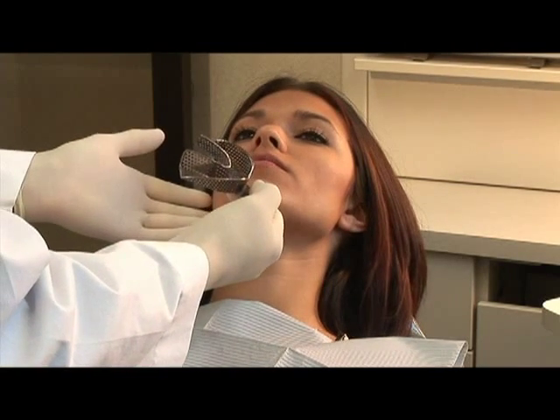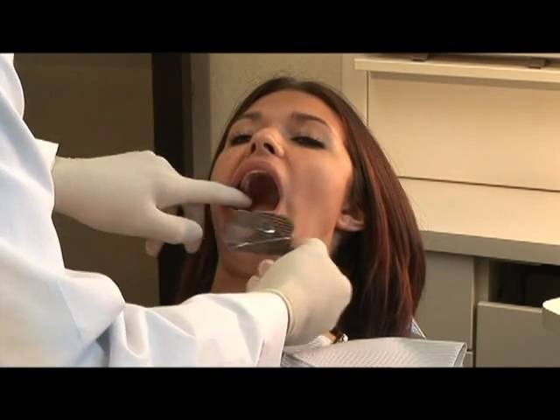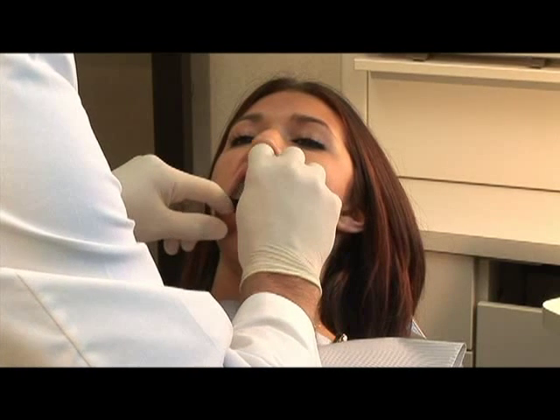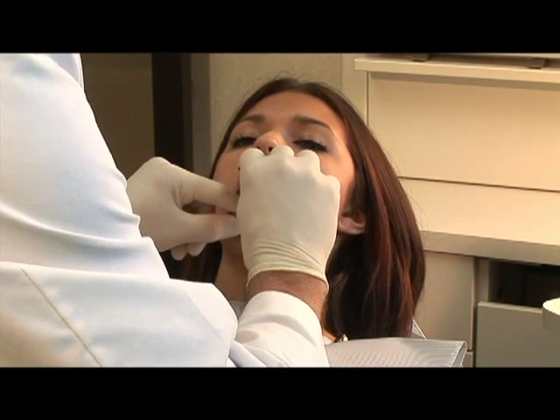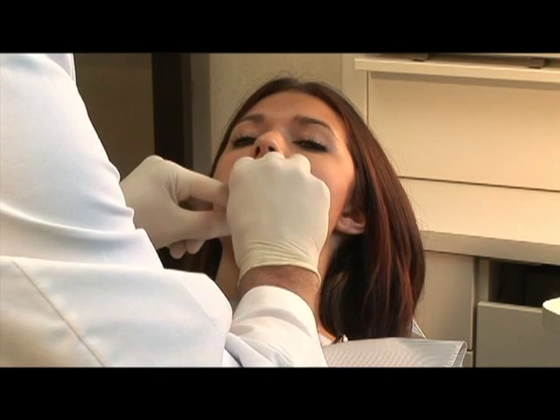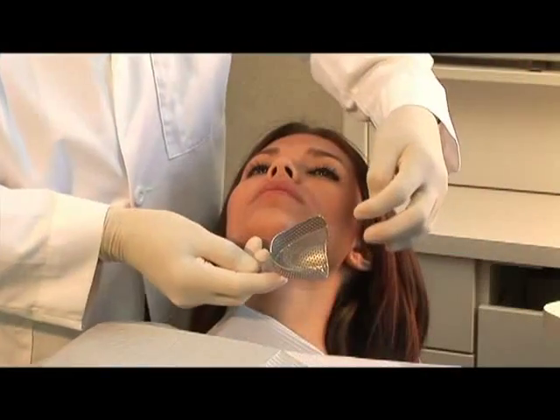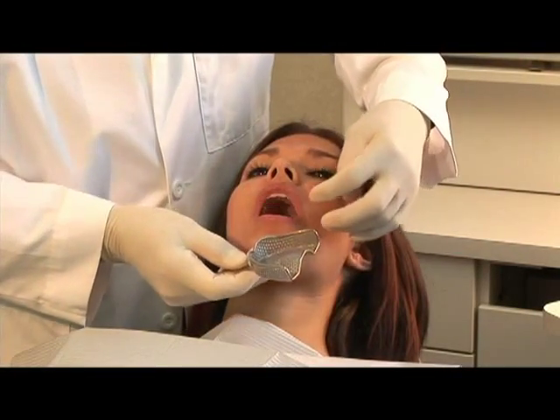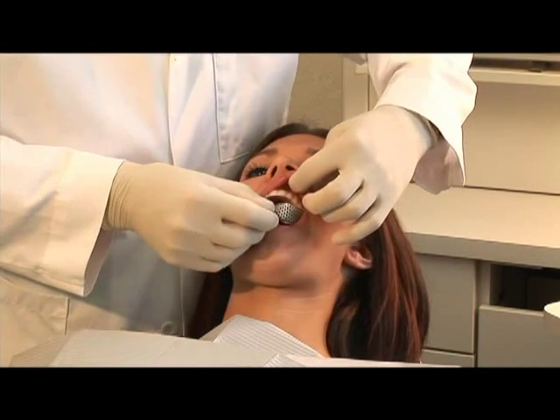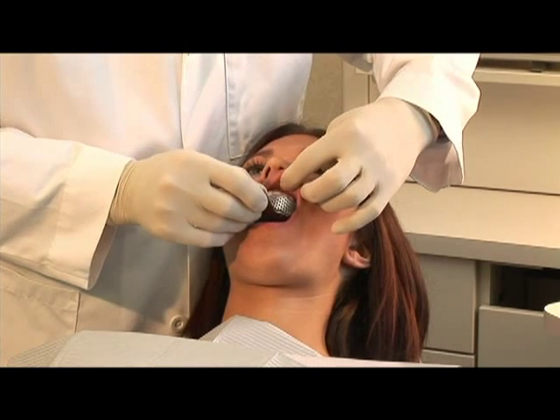We must first check the tray's fit in the mouth. Starting with the lower tray, rotate the tray into the mouth, then have the patient raise their tongue prior to seating of the impression tray. Be sure there is no impingement on the soft tissue. This procedure is then repeated by sizing the maxillary impression tray. Once again, make sure that there is no impingement upon the tissues.